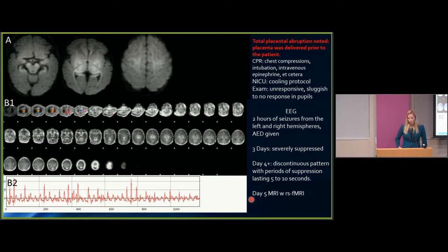And this is what their anatomical MRI looked like at the time after birth. So there was diffusion restriction in the deep centers of the brain, but largely the cortex was normal. This sounds a lot like how Ammon's MRI looked. So diffusion-weighted imaging in the acute period can have findings that still leave doctors without enough objective information to predict their outcome. Below is a summary image of his resting state functional MRI of all levels of his brain, showing no networks and only cardiac pulsation through there. This individual developed full body extensor tonic posturing and passed away days after this exam.